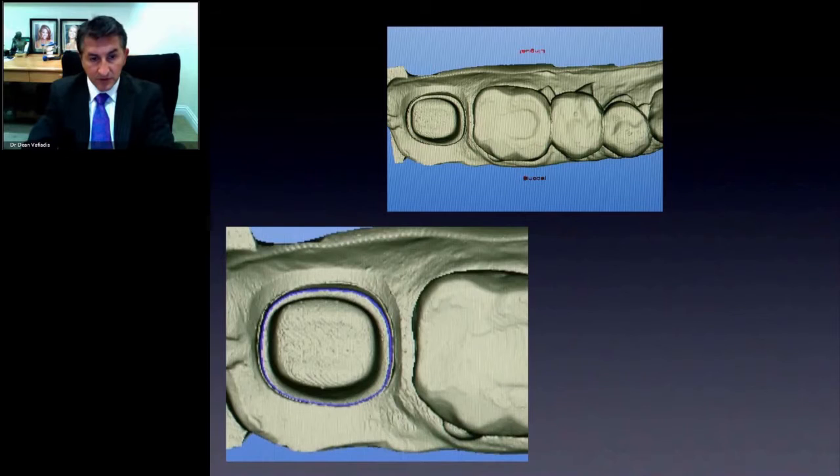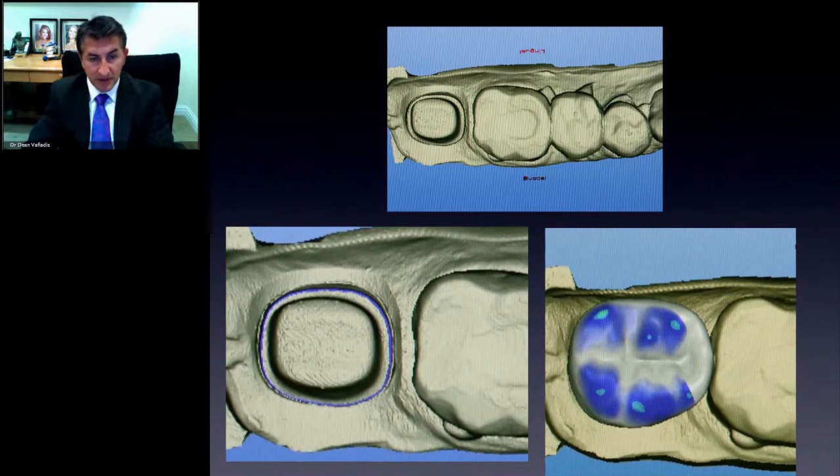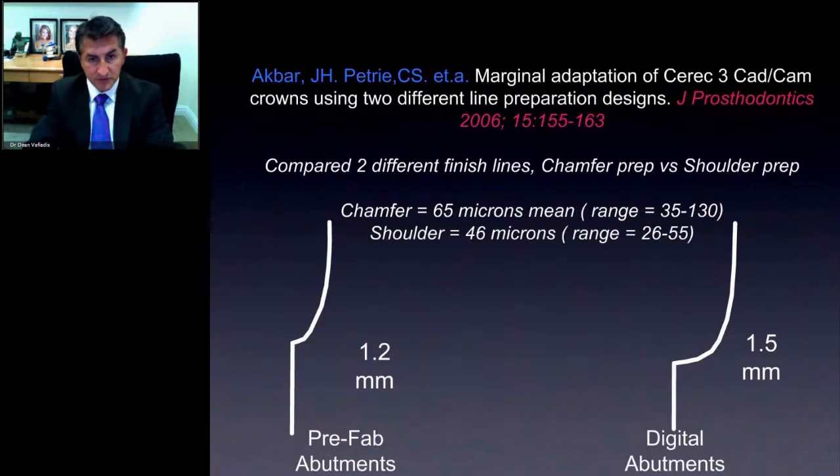So here, a good way to do that is if once you get the abutment back, if you have a scanner, you could just scan it. So once you scan it, it's basically like a regular preparation. You can't tell that that's a tooth or that's an implant because of the size of it. It doesn't look really small. Sometimes you see some restorations and the prefabs are too small, and that's going to allow for a lot of food impaction. So we could scan it, we can marginate, we can mill out a crown in this situation.